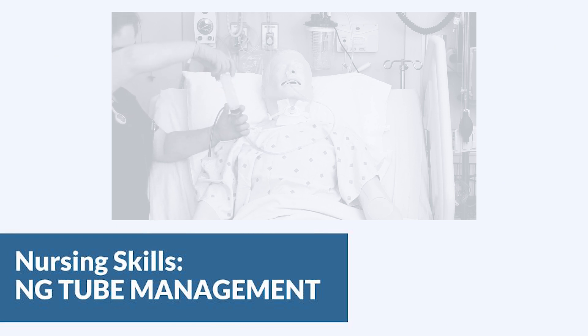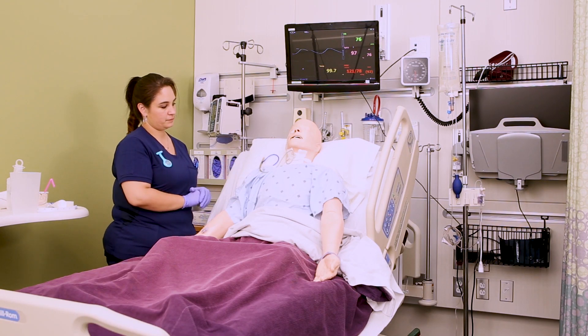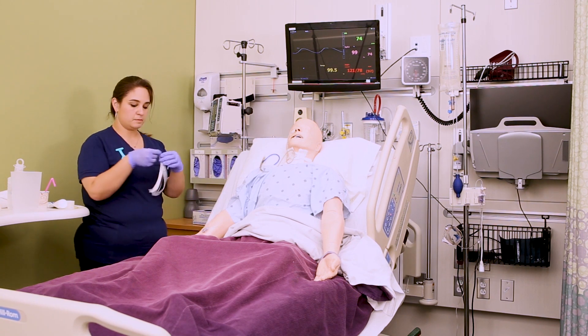In this video, we're going to look at a couple of the things you need to do when managing a patient who already has an NG tube or nasogastric tube. Let's say we just placed this NG tube and it's been confirmed by abdominal x-ray — that's the gold standard.